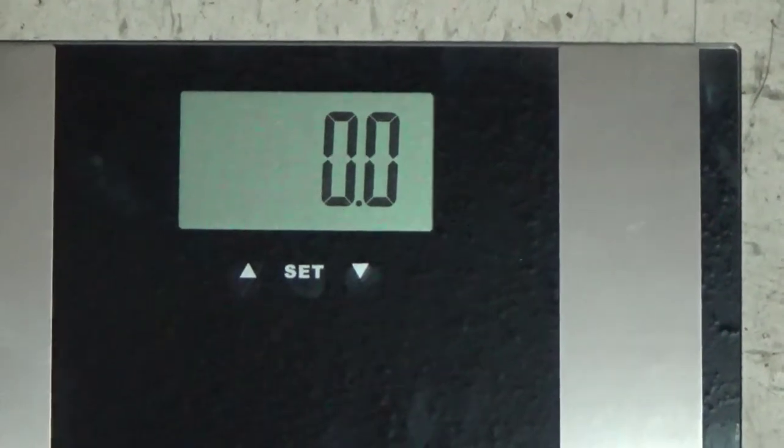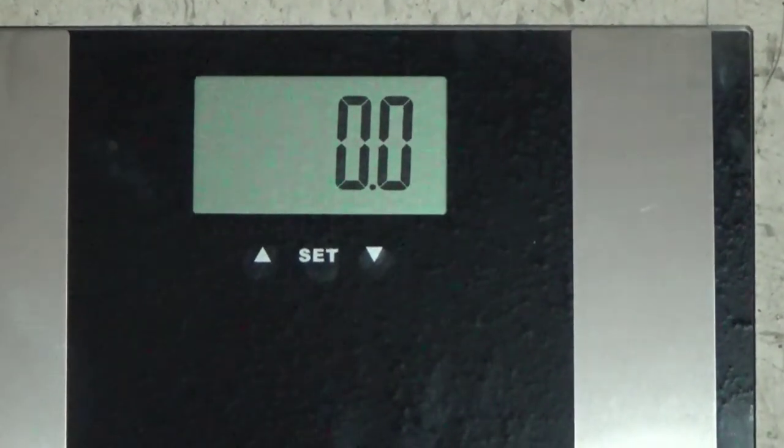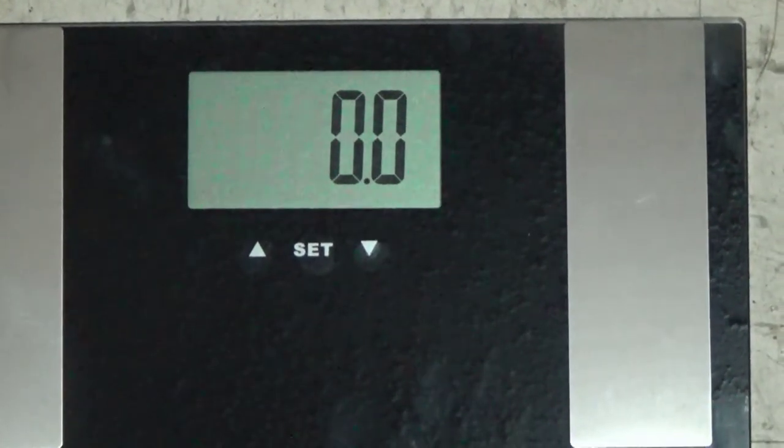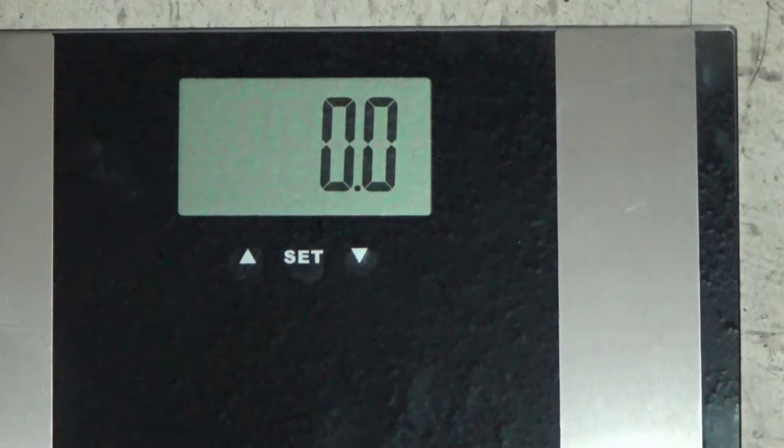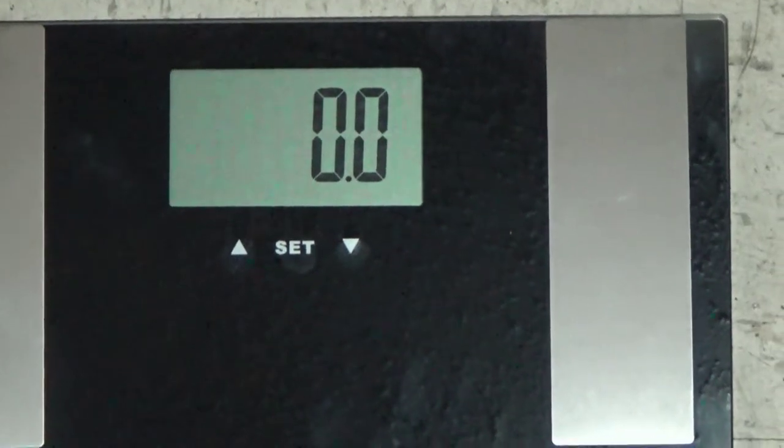Once you do this, you don't have to do it again. If you go from one room to the next or go outside on concrete, just do this process. Just step on it once and let it zero itself out. After about ten seconds it'll go blank. Once it goes blank, just step on it and it's gonna give you your weight.